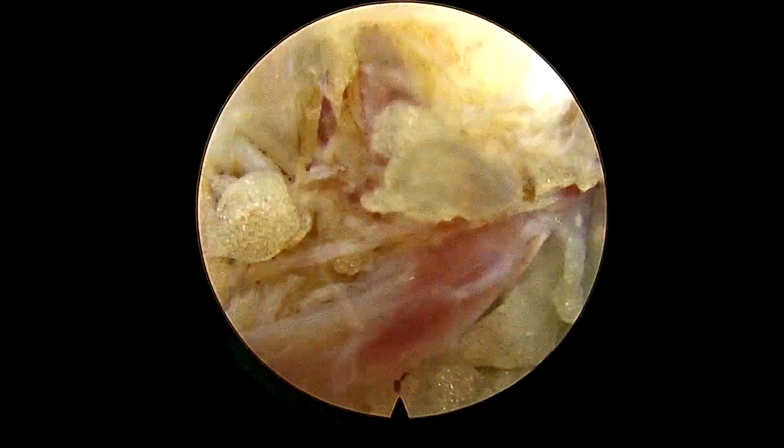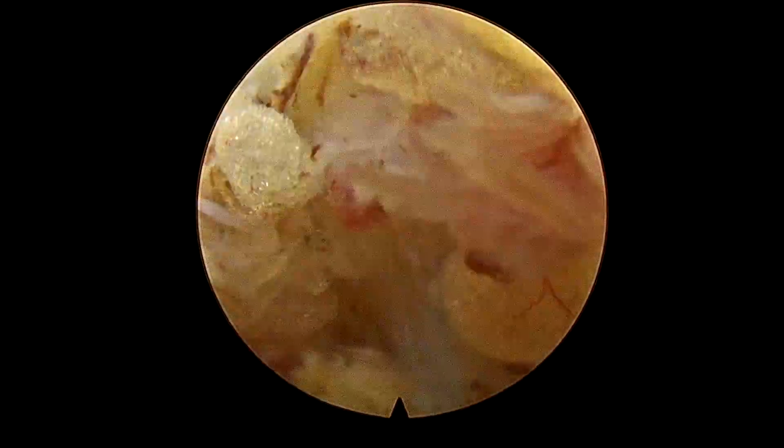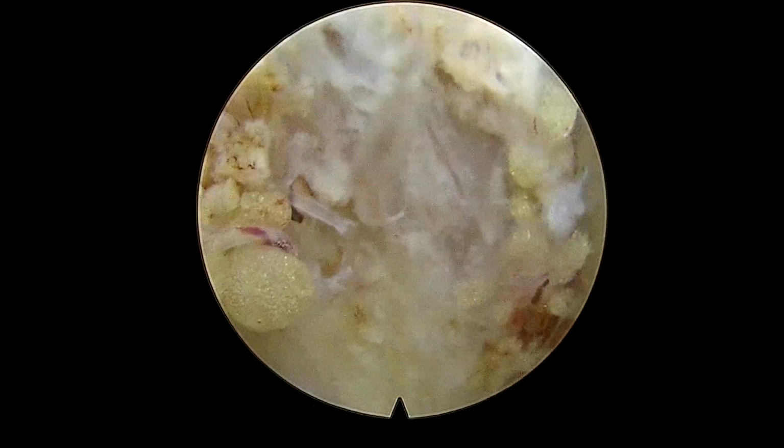This is again very important. Do not try to just remove those soft tissues with the help of forceps before coagulating, because sometimes the muscle tissue in the interlaminar window bleeds like hell. So try to avoid its manipulation before burning it. I have coagulated, and now I'm removing the soft tissues from the interlaminar space here.